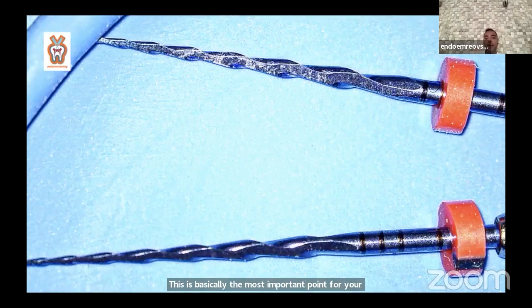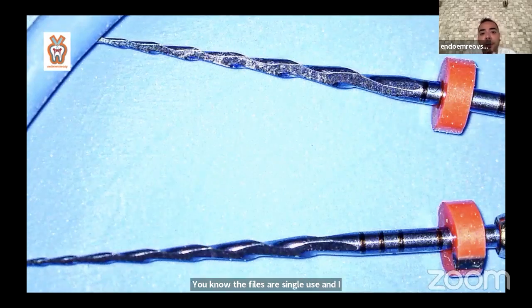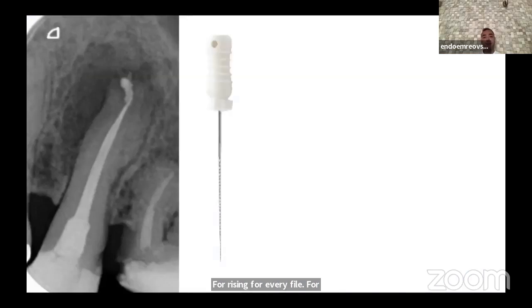I test the file with artificial canals, and you see the difference. As an endodontist, I don't recommend using the file more than once. You know, the files are single use, and I advise you to use the files just once or twice, no more, for every file, not just F1, for every application.